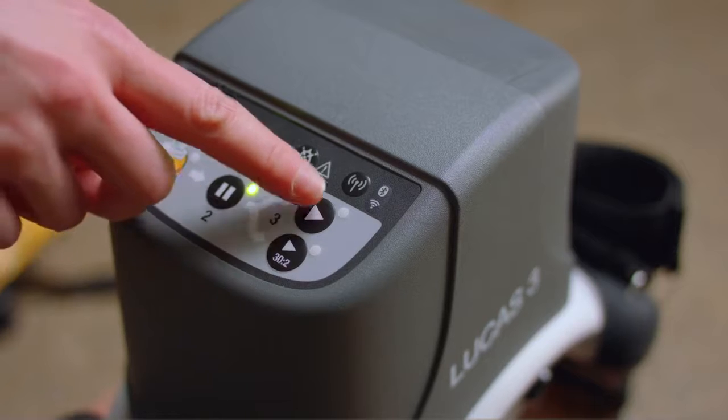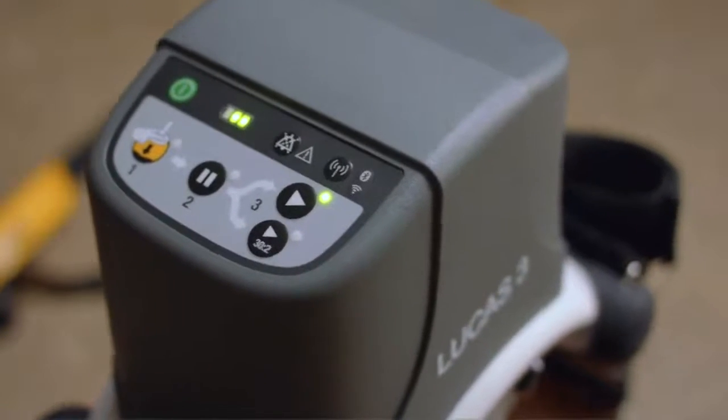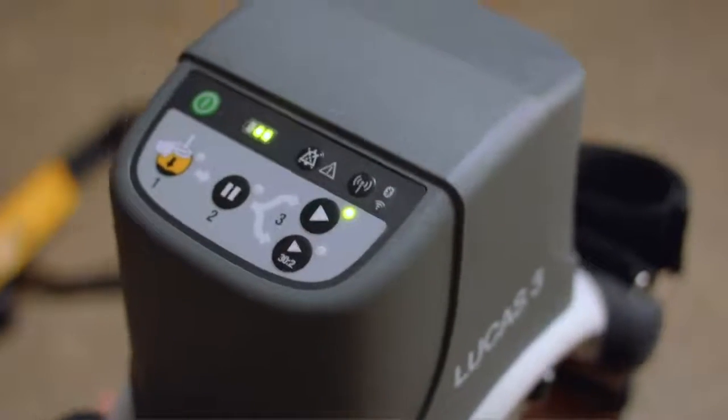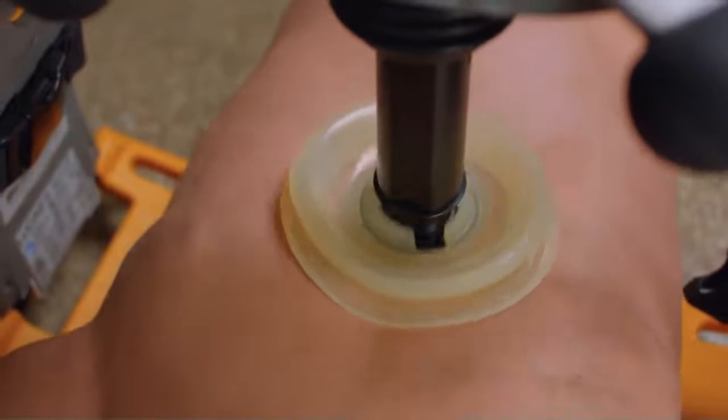You have two options from this mode: 30 and 2, or continuous compressions. The three control steps allow for only a few seconds off the chest. Remember to prioritize proper placement. And that's it. I hope this tip helps make your job easier so you can focus on saving lives.